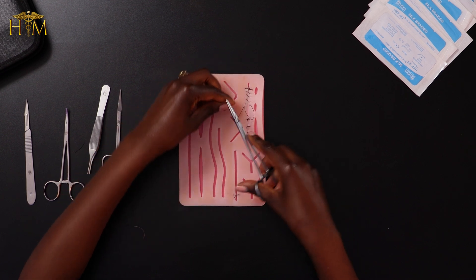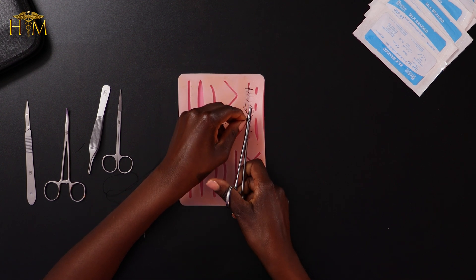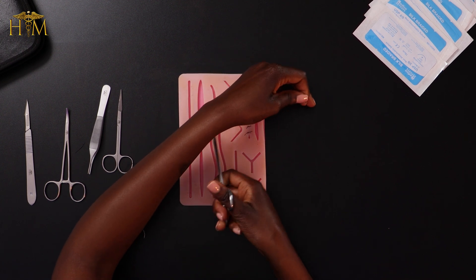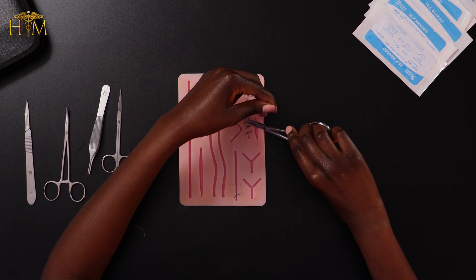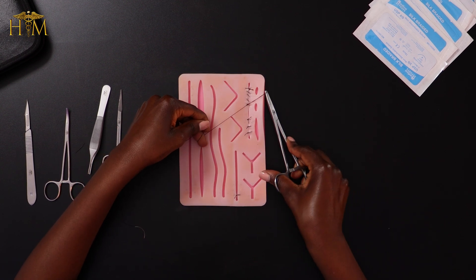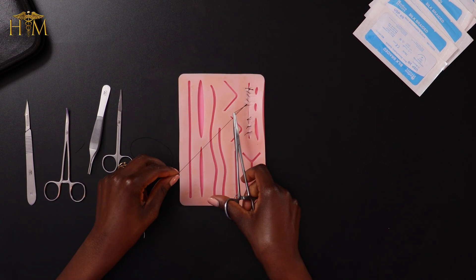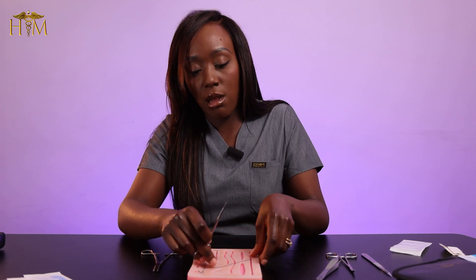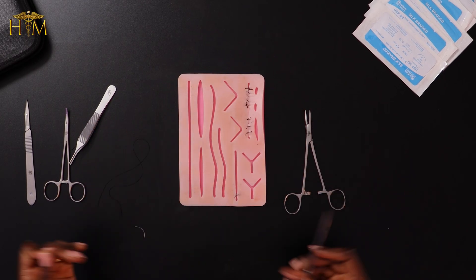Wrap my suture around twice, grab the loop — I've just got my suture locked in there. Free that up and pull. Then wrap once in the other direction and pull. And one more time, wrap in the other direction and pull. And there you go. It's actually exactly the same as the instrument tie that you already know how to do. It just means that at the end I have three sutures to cut instead of just two. So I'm going to cut like this — and there you go. Running suture.